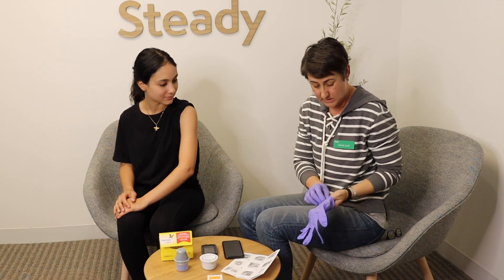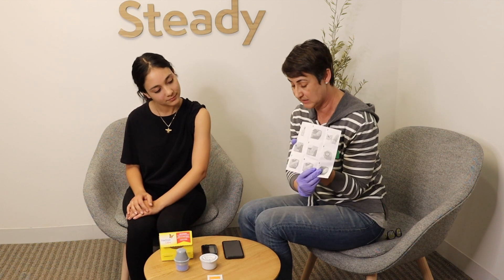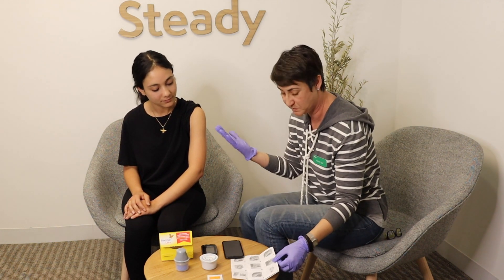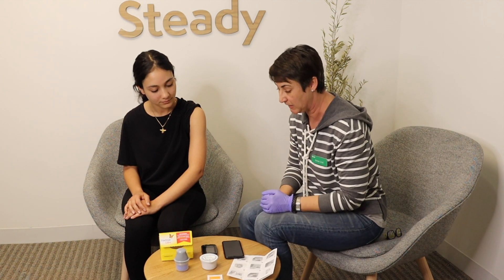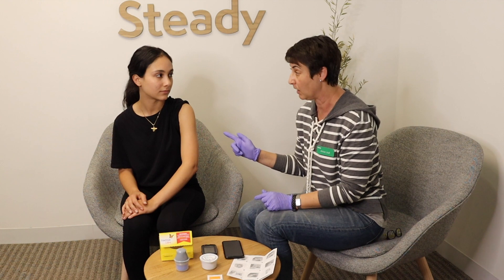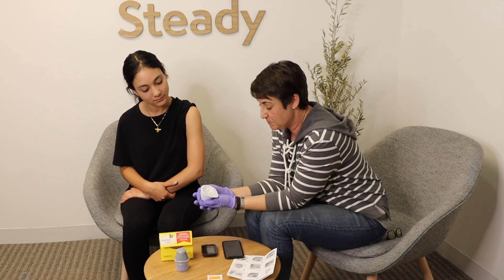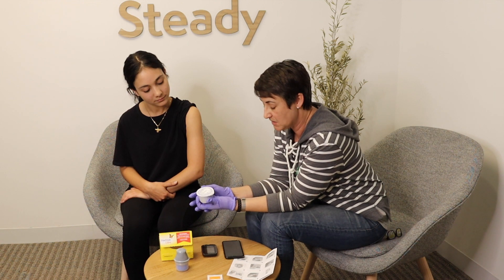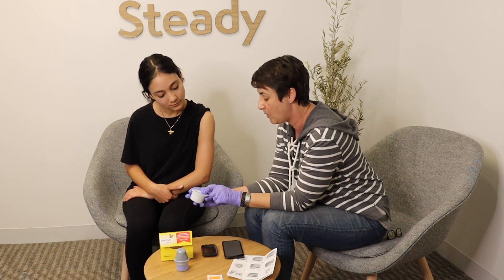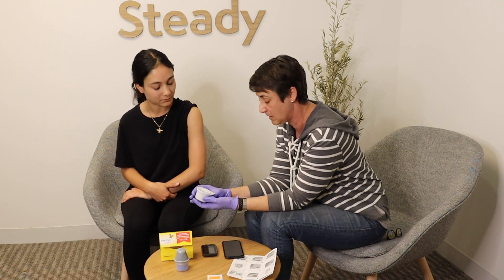I always have the manual instructions out and available in case I get interrupted by a phone call or anything, so I know where I can pick up. This device is only approved to be worn on your arm by the FDA at this time. So the first thing you should do is pull the sensor out of the box and check the expiration date — you do not want to use these products if they are expired.